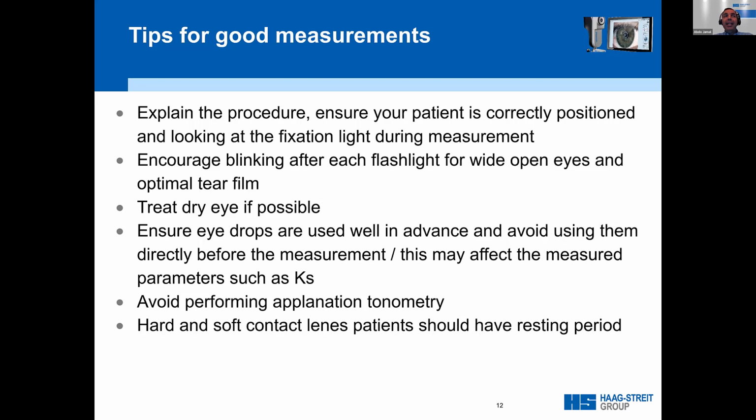Treat dry eye if possible and ensure eye drops are used well in advance, because using them before the test may affect the K readings while measuring the Ks. Avoid performing applanation tonometry first, and for hard and soft contact lens patients, please ask them to remove their lenses for at least 2 weeks before the examination.